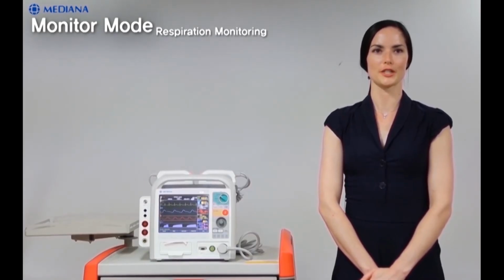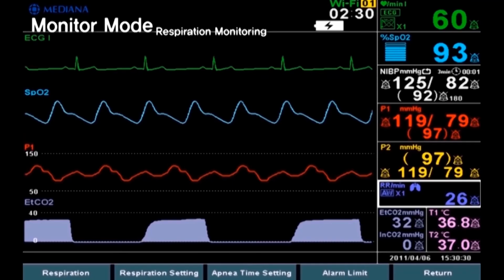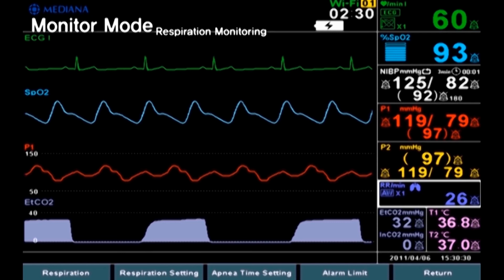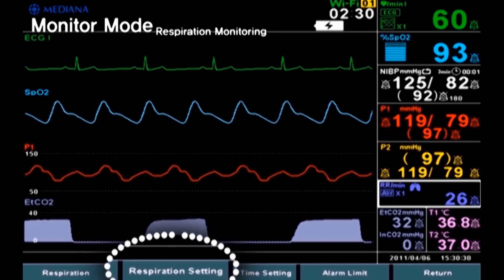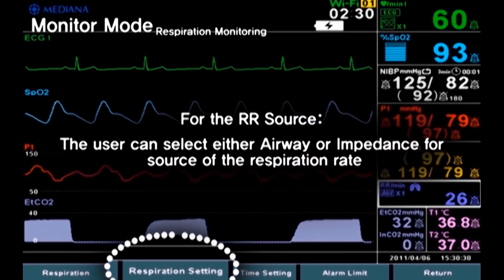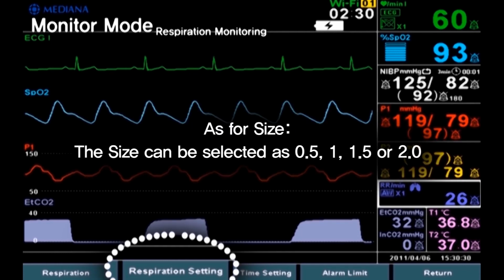Let's see the respiration monitoring menu. Number 1, respiration. Respiration can be turned on or off. Number 2, respiration setting. The respiration rate and size can be changed. For the respiration rate, the user can select either airway or impedance for source of the respiration rate. As for size, the size can be selected as 0.5, 1, 1.5, or 2.0.